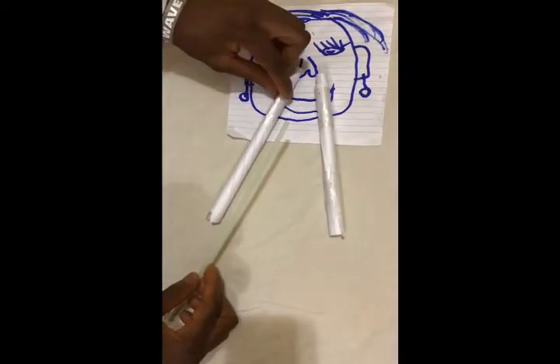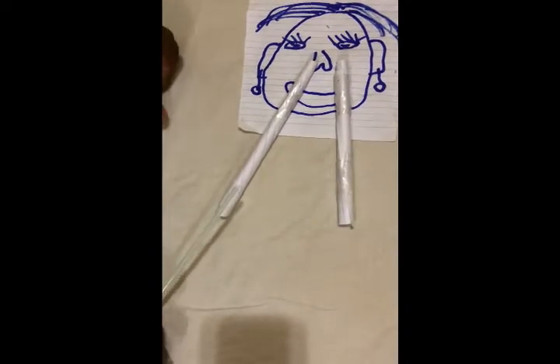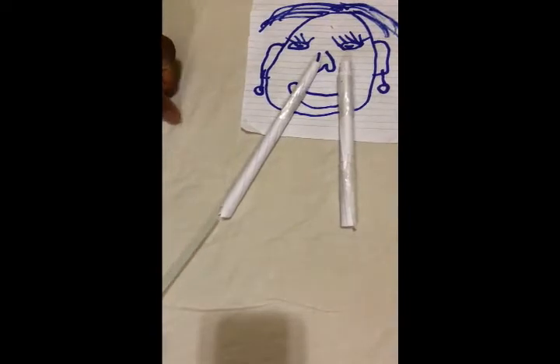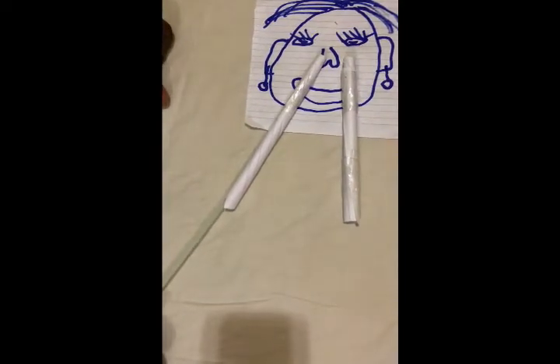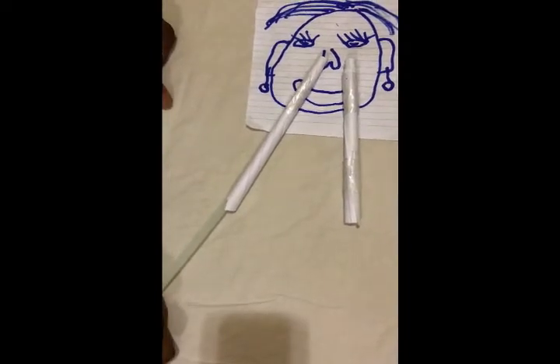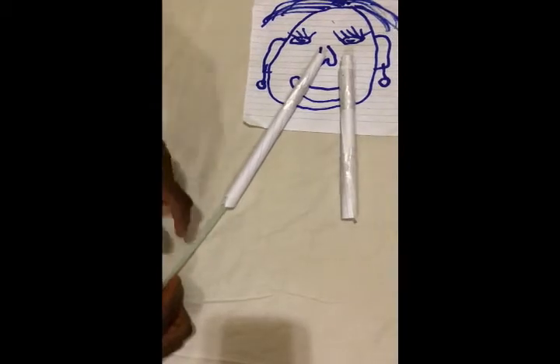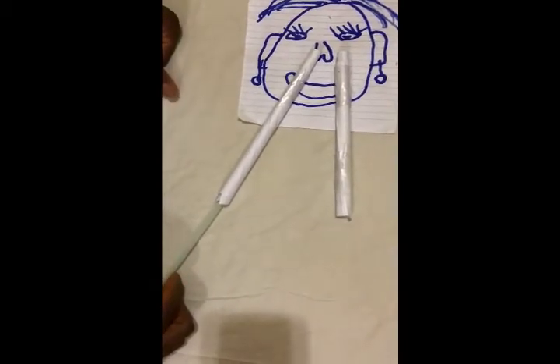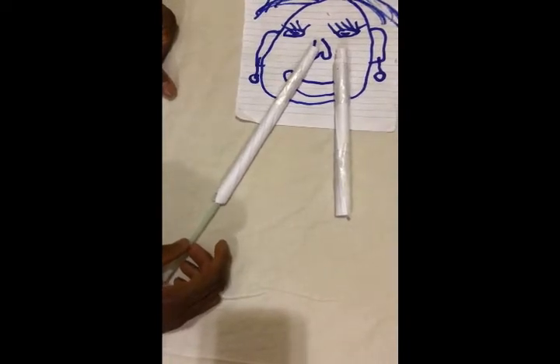When you insert, you follow the anatomical curvature of the nose. In this case it's not really possible, but you follow the anatomical curvature nicely, and you direct the tube towards the floor of the nose to the oropharynx.